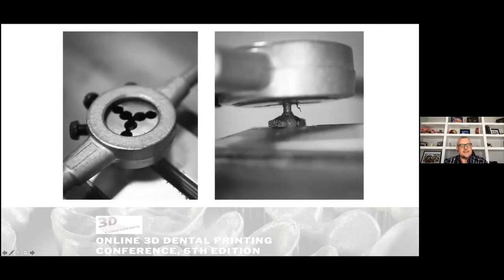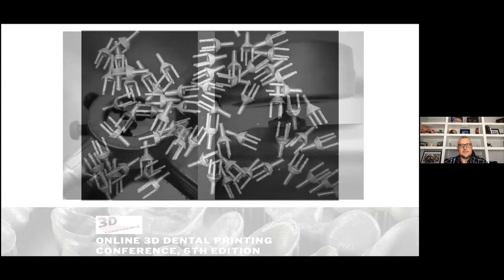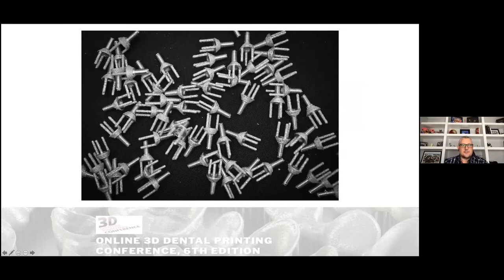And then we brought over a die, okay? So old school die, and we're chasing the threads onto that shaft, okay? And there's our finished products, all right? So we have essentially a hybrid manufactured product, employing additive manufacturing and then subtractive manufacturing for the threads.